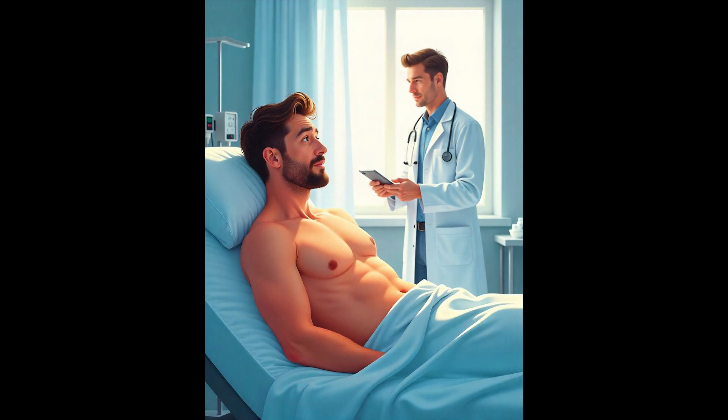It's difficult for some patients to fully relax because of tremor — for example, essential tremor, Parkinson's disease, or arthritis. These patients should be placed in the most comfortable position.